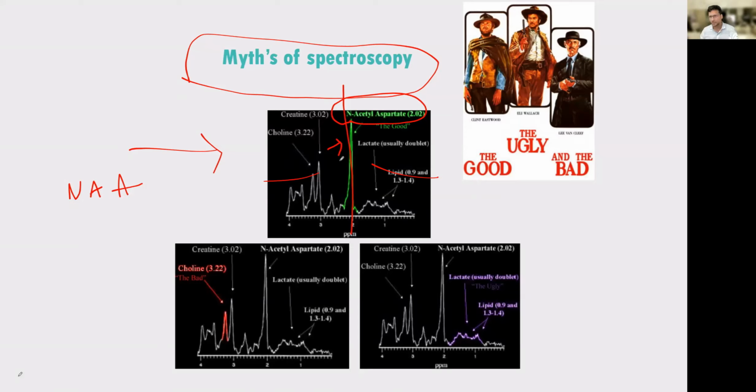If you randomly sample multiple areas, definitely in the temporal lobes and parietal lobes, there will be decrease in the N-acetyl aspartate. Similarly, there will be other peaks like increase in myoinositol and all. This is all documented. But basic is N-acetyl aspartate will decrease in ill health. This is one first point.